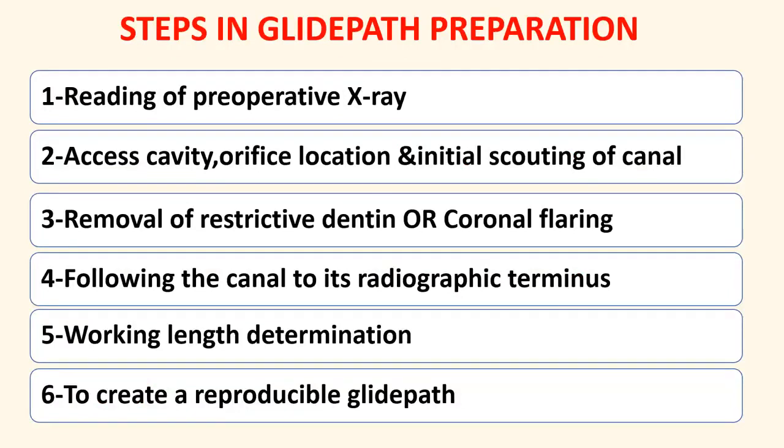Now coming to the actual steps in the glide path preparation. These are the 6 steps in the glide path preparation. We will discuss each step in detail with video presentation as well.